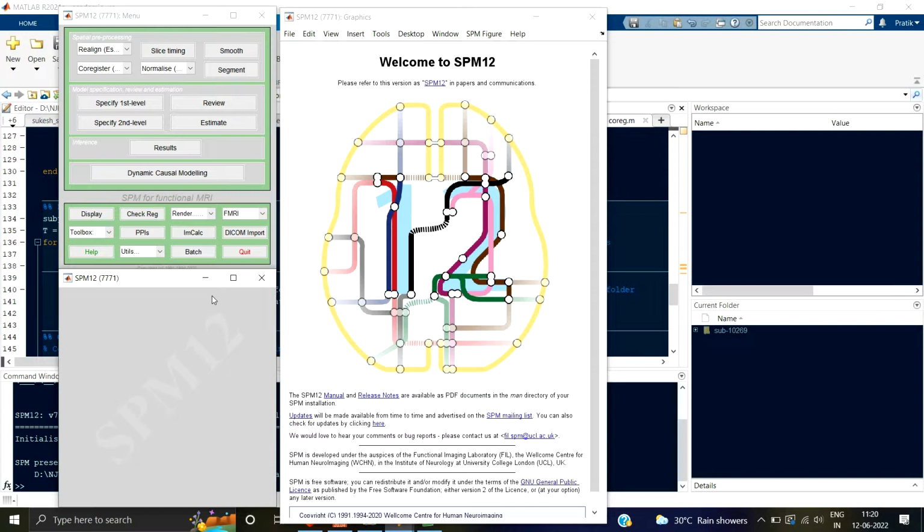Here I'm going to tell you what problems you may face during co-registration of some subjects and how you can rectify that. We'll see the manual method of rectifying the problem, manually reorienting, and the other methods are either using AFNI, you can skull strip the brain, or using FSL you can skull strip the brain. So we'll see all three methods: manual, AFNI and FSL. So that's about this video.